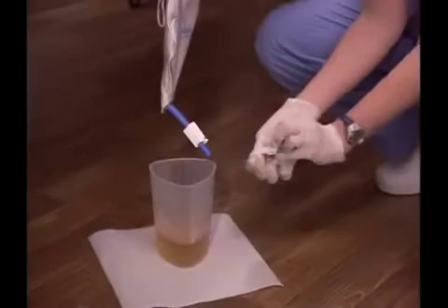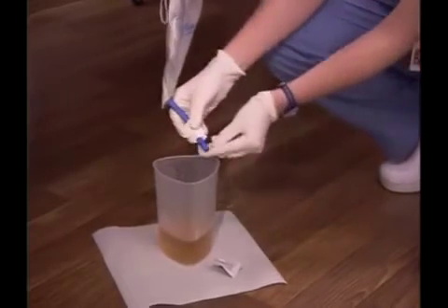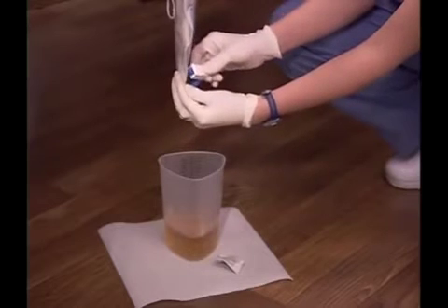Then clean the emptying spout with the alcohol wipe or according to your facility policy. Then return the emptying spout to its holder. If the person is on intake and output status, measure the urine. Note the color, amount, and quality before emptying the contents of the graduate into the toilet.